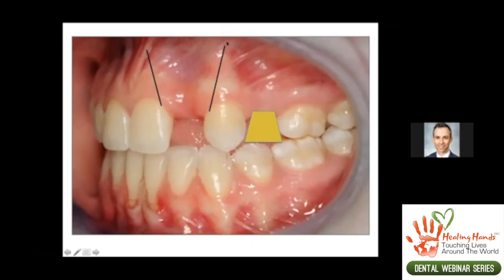What I don't like about this incision design is typically this incision falls right over the canine and the central incisor eminence and is more likely or at risk of breaking down, and then you can have exposed bone and fenestration here. So for that reason, I don't like this incision design.